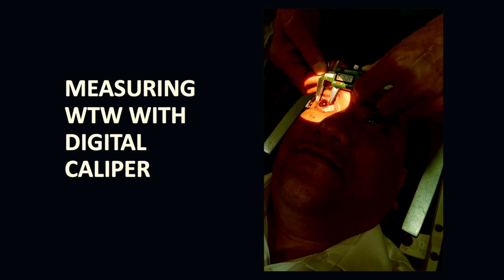We had to measure the white-to-white distance, which was over 14.8 mm, with a caliper, as it was too big for the IOL Master 700 to image.